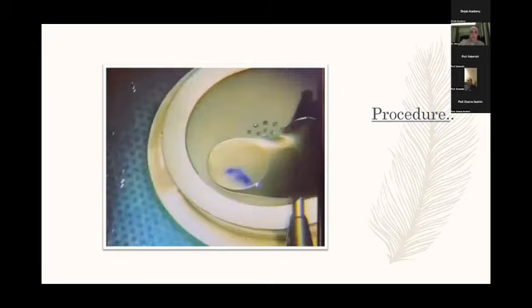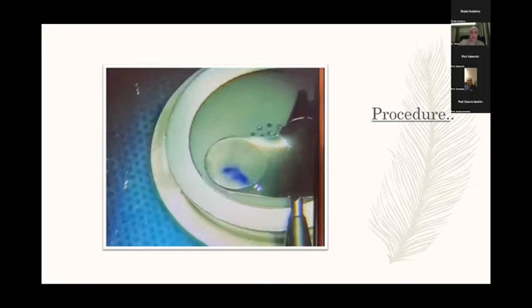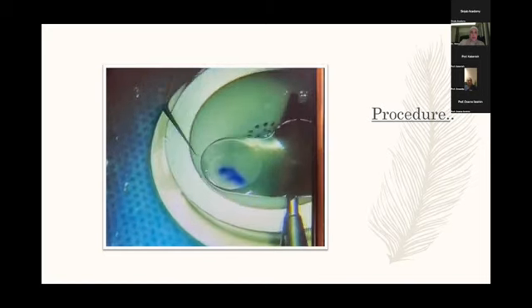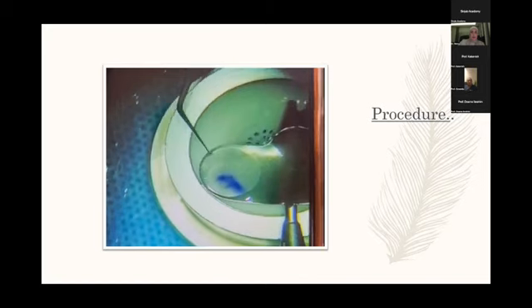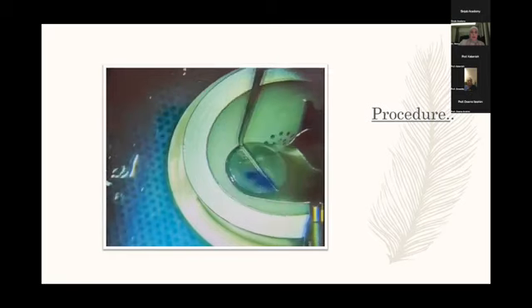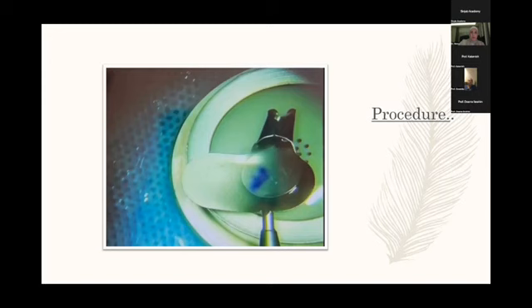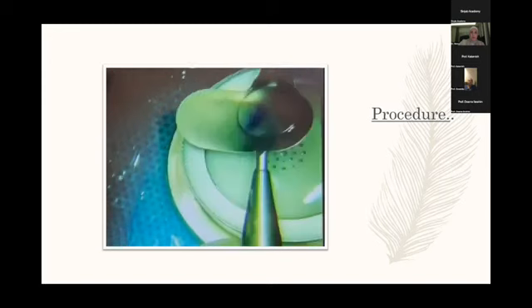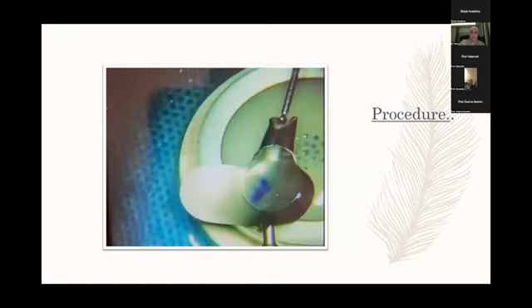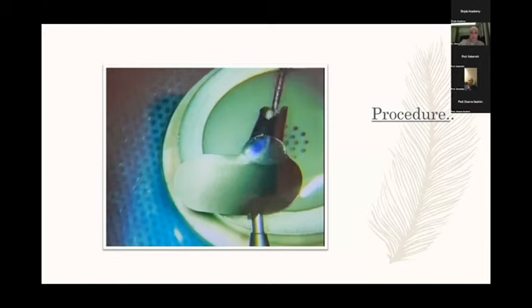As you see, I try to bring it to the lip of the glide. So this is the reverse Sinskey hook, and this is where I use it. There was a small tag here. I use it to bring it into the lip of the Busin glide or Busin spatula. And then I use my micro forceps to pull it to the lip of the glide.